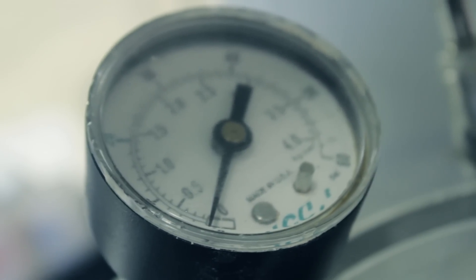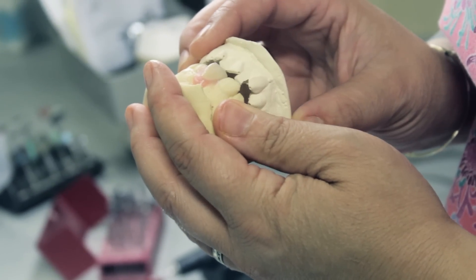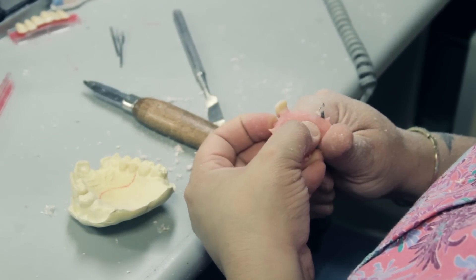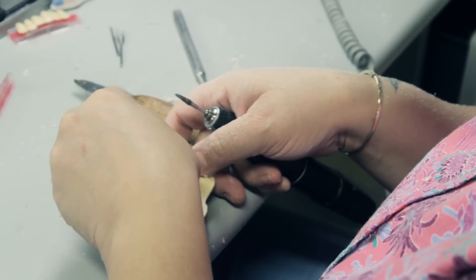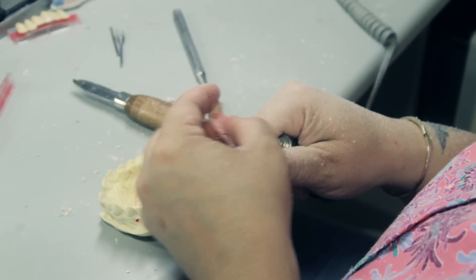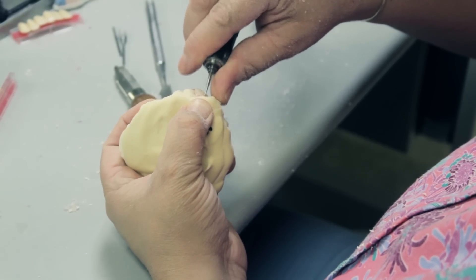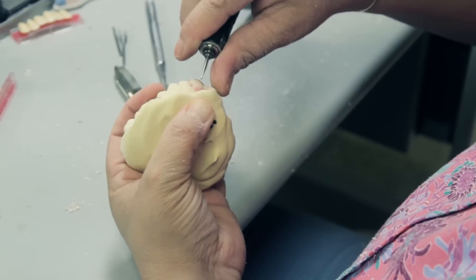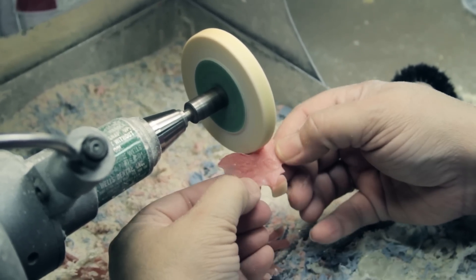Once the curing time is done, blow off any excessive water, check the bite, make sure the tooth hasn't shifted, your clasps haven't shifted, or if there's any excessive acrylic holding the bite open. I'm cutting slightly, making sure that it fits the model the same as it will fit in the mouth. I take a small inverted cone burr and go around the neck of the tooth to give it that lifelike look — that separation from the acrylic, the tooth from the gums. I now take the remaining bulk off the appliance, finishing to my red line.